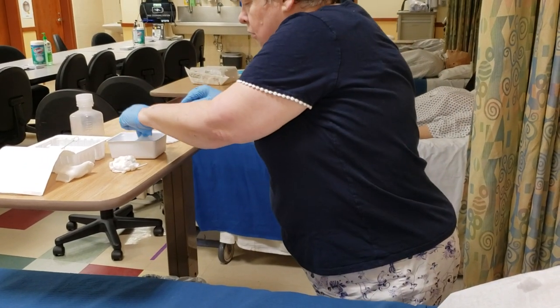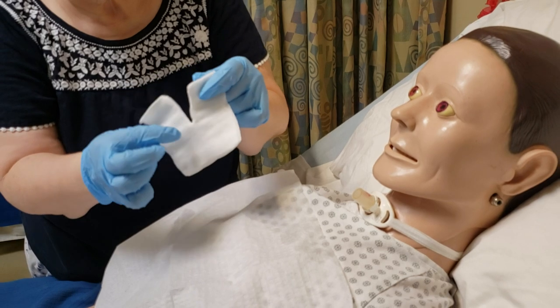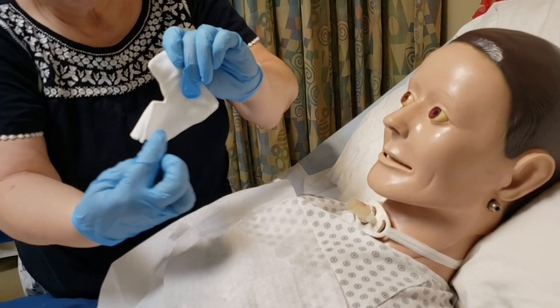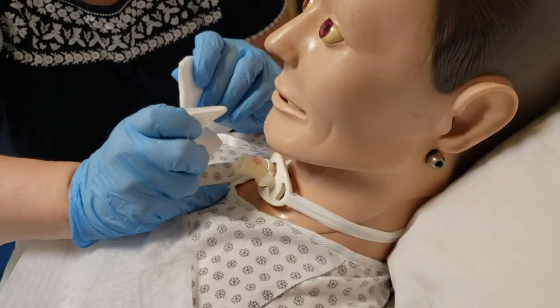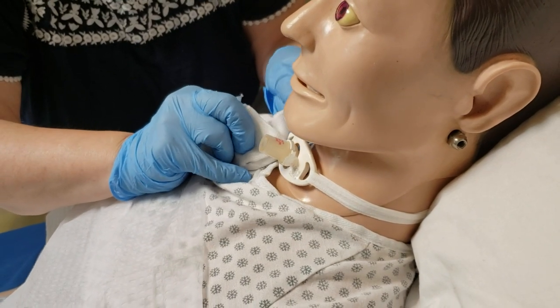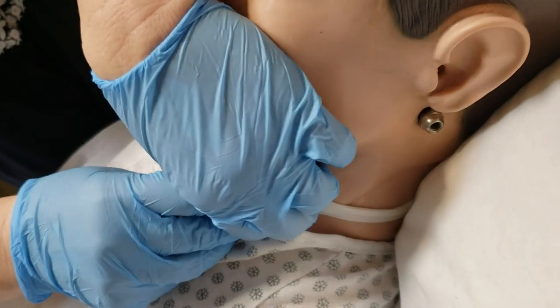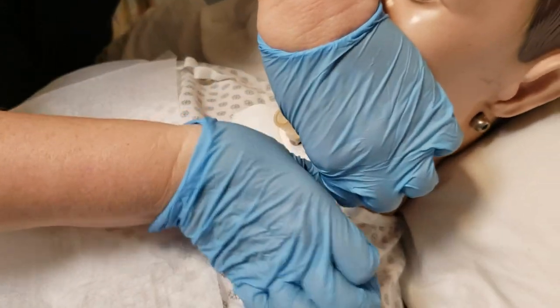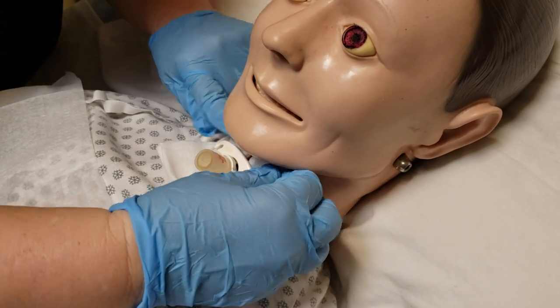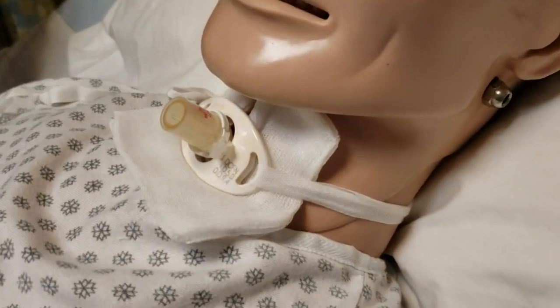Now go ahead and put your new dressing on. You can see this one is almost like stitched around — the threads aren't hanging out. Do the best you can to keep this area nice, sterile, and clean. This is the hardest part about changing a dressing — trying to get your fingers under there. Get your dressing back around and make sure you pull it up in there so it's tucked around. And that's pretty much it.